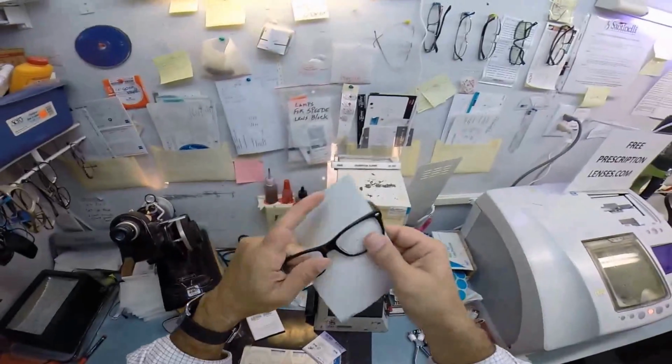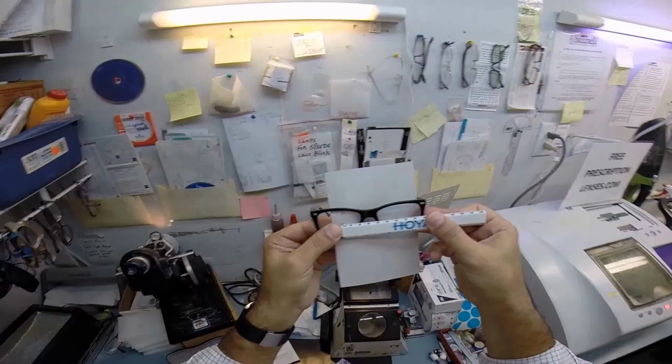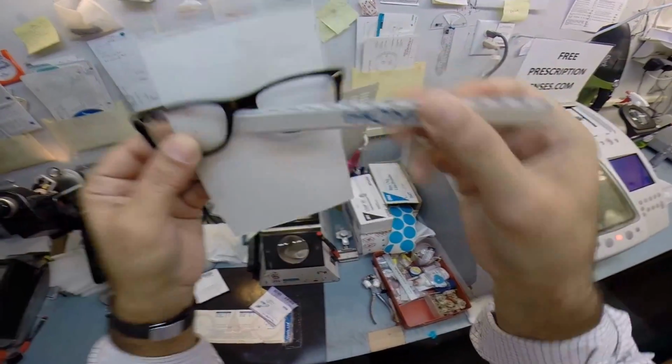Your pupillary distance is 61, so I'm going to put my PD stick against my thumb on your right lens, and then when I hold it up on your left lens, we're getting 61 millimeters, so that is made perfectly.